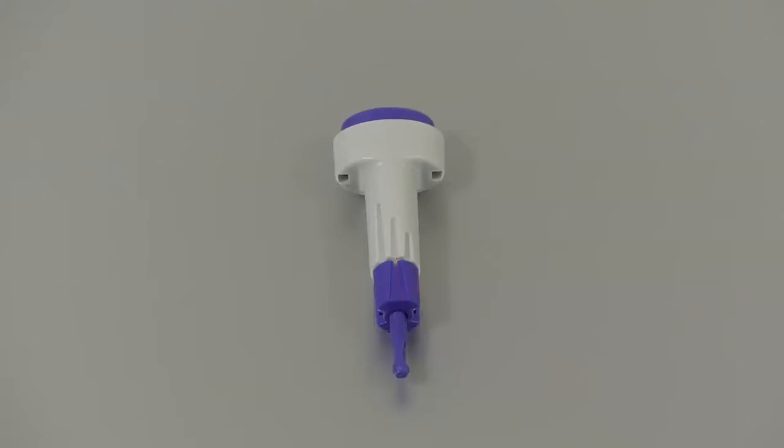To change the depth setting you rotate the middle section, however safety lancets are commonly already on the middle setting.